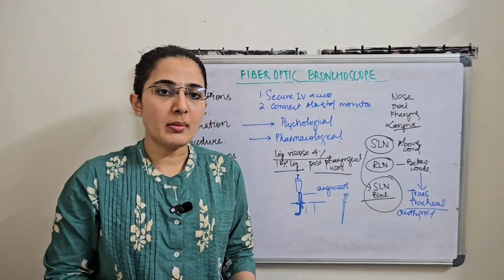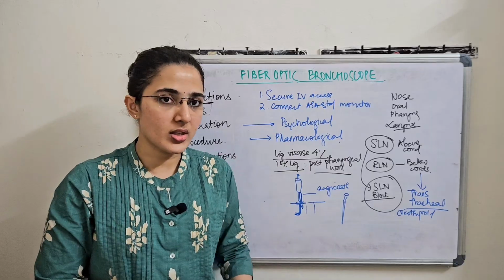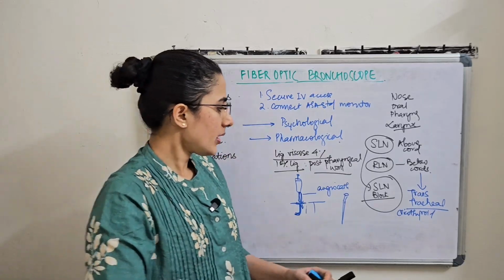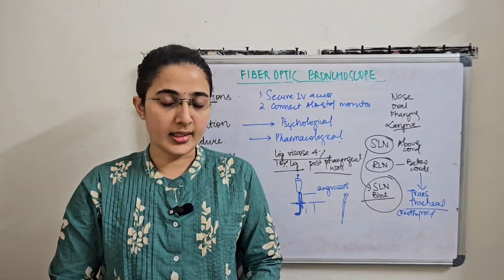One thing you have to remember while doing this is to tell the patient that they may cough post this injection, so it is nothing to be worried about. So we have seen the transtracheal injection of local anesthetic.